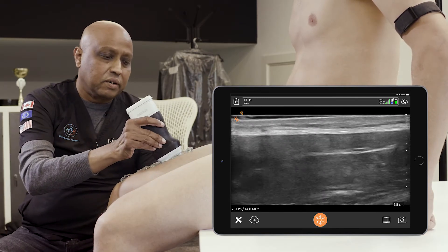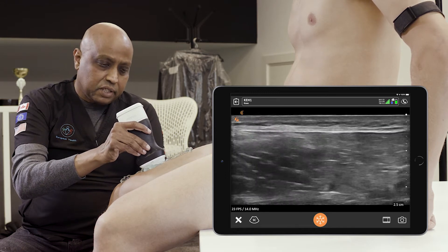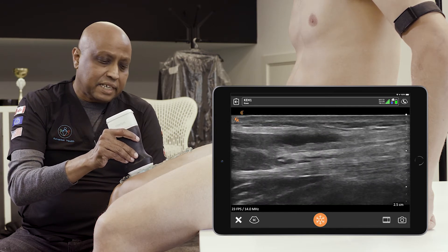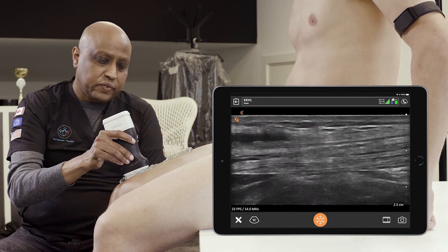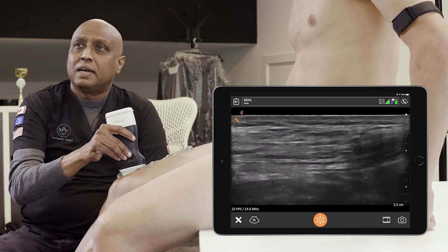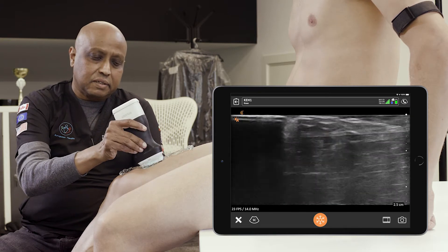We are capturing post-exertional and competition impacts on the given joint — in this case, the knee. We start at the rectus femoris in a cranial-caudal longitudinal, sagittal scan. As I move distally towards the superior pole of the patella, I can appreciate the quadriceps tendon.